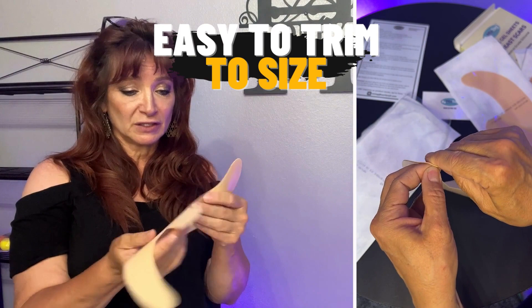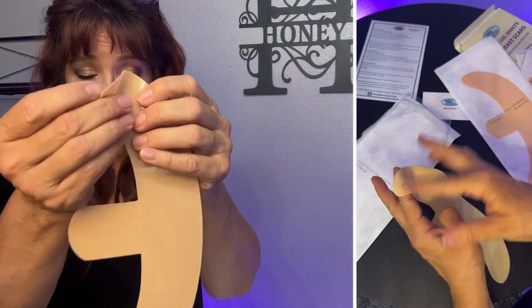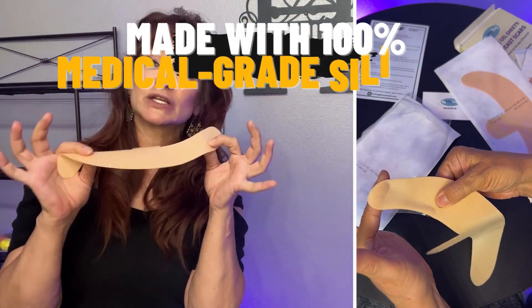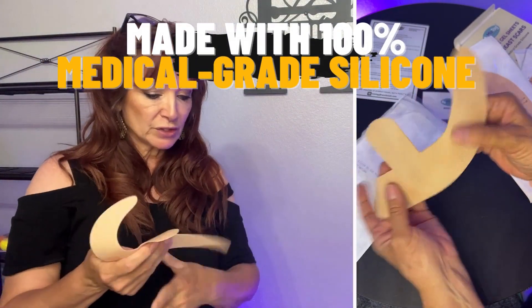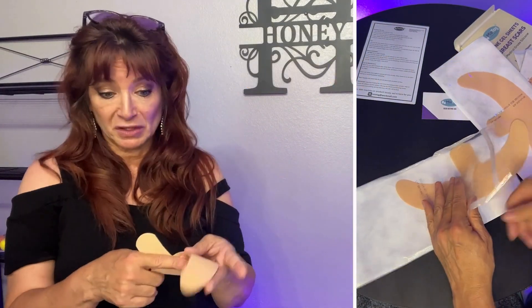I think this is gonna feel pretty soothing. You can actually wash these and reuse them, so this is going to have a pretty good longevity for you. It's not just a one and done when you buy these, so that's kind of cool.